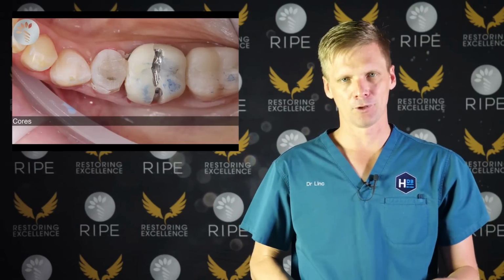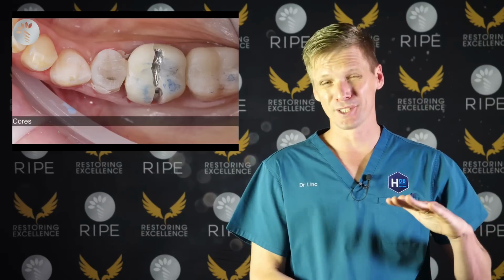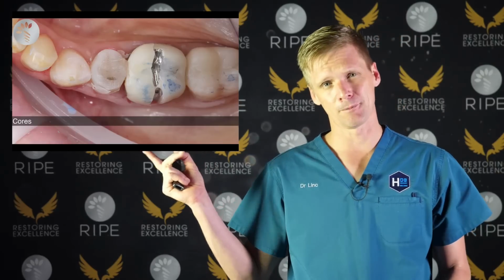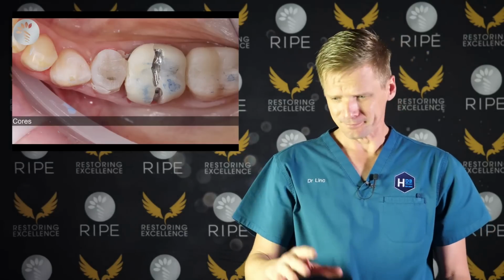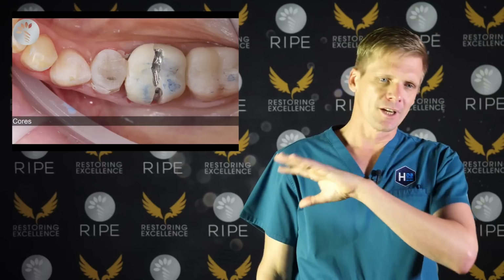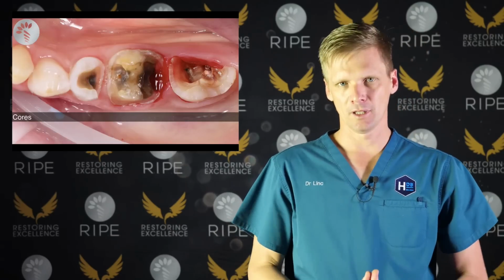There is another reason to have cores that are beautiful. It makes life much easier for your technician. It makes it easier for almost all dental materials to be even thickness. It makes it easier for casting. It makes it easier for milling. It makes it easier for pressing. I have a technician up the road. Go and visit your technician and take them to preps and ask them which one is easier to work with, okay? If you have a big, sharp, jagged point, it's so easy to wear that, and then your crown sits high, and then you'll spend hours trying to get the crown to fit. So besides everything else, cores are incredibly important for getting your technician to think you're a good dentist.